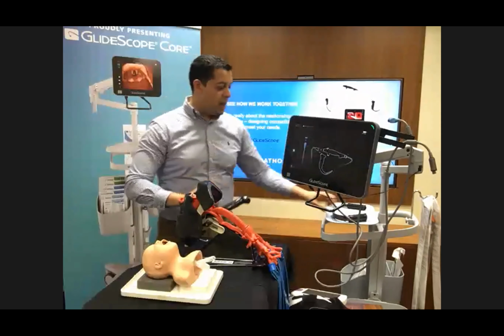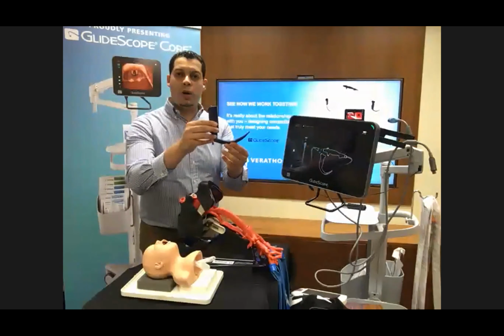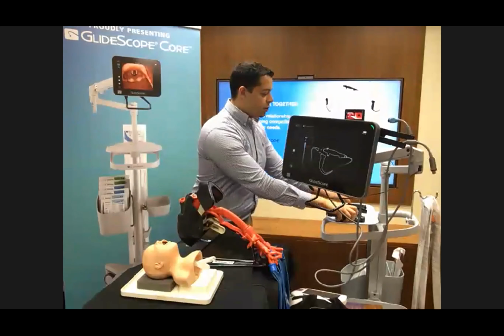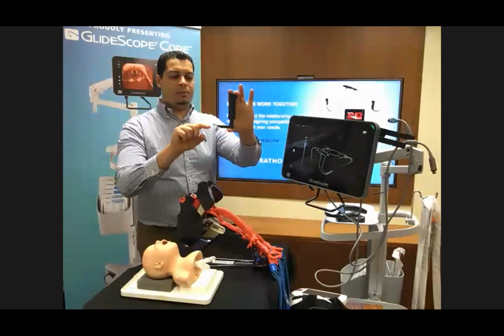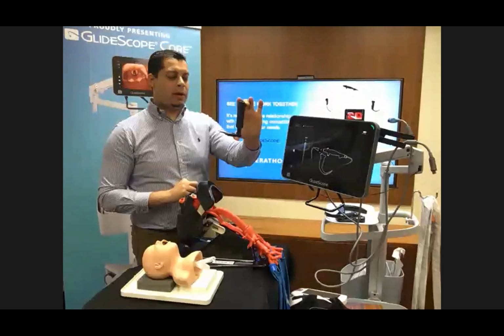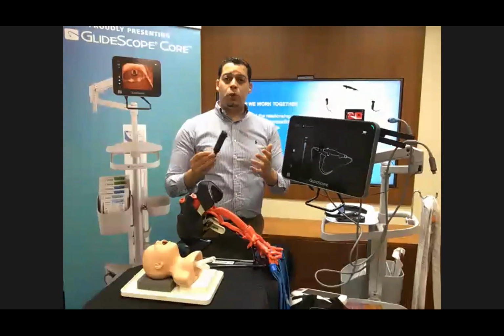And we also have the MAC blades, where you can see here sizes 3 and 4, for those who prefer them. These types of blades can all connect, in addition to the Miller blades for neonates and pediatric. As you can see, this is a Miller blade, and this can be used for neonates and pediatric. We have size 1 and 2. And all these blades are disposable.